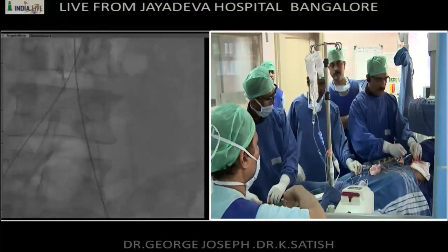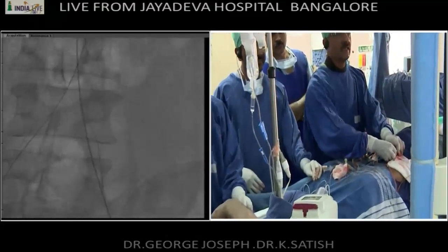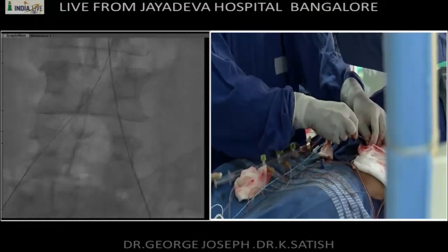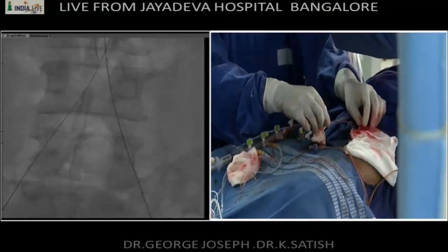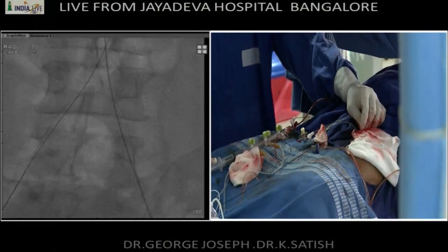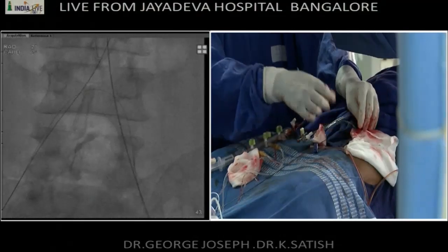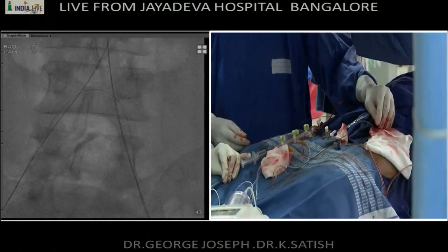The challenge here is to cross the CTO without raising a flap in the terminal aorta. I think there is not enough room here for this catheter. What F is this? This is 6F. Give a 4F, I think. Otherwise, we'll go bare and take the sheath out and put the sheath back on. I think a 4F catheter is better, then we don't need to remove the sheath.